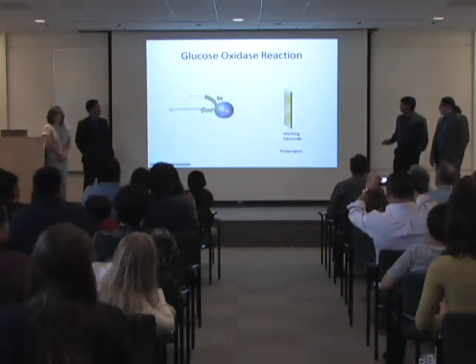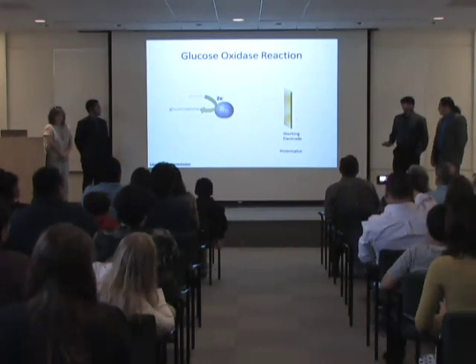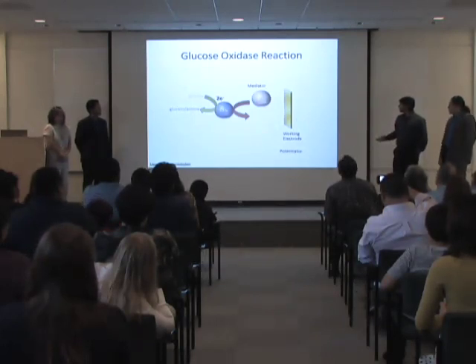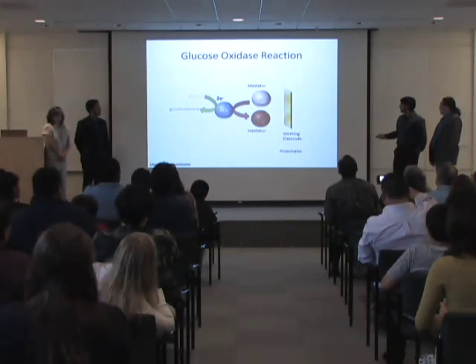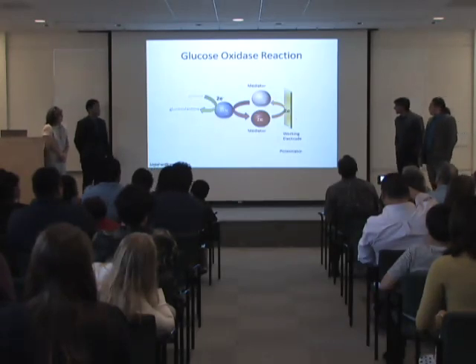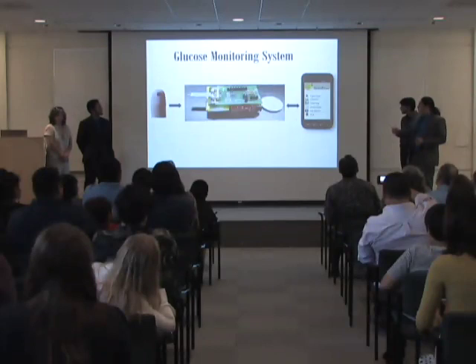Now, it wants to give away these two electrons to the electrode that's built into the test strip, but it has to first go through what is called a mediator. Now, this mediator will take the two electrons from the catalyst and will then be able to send them to the electrode. And once it does that, the electrode is now charged with current, which can now be used. So this is how our device works.